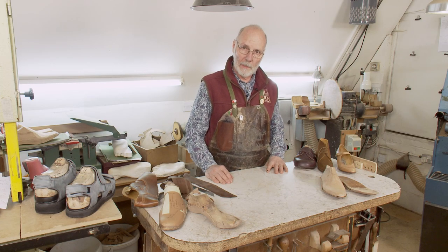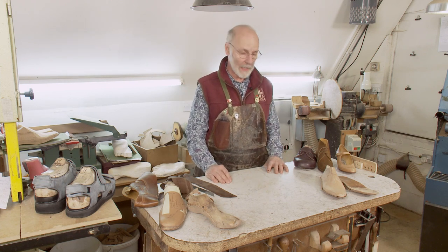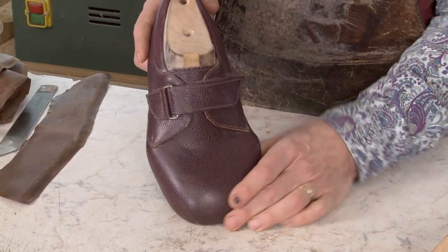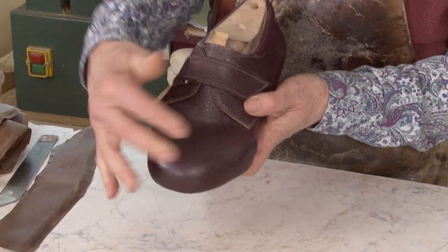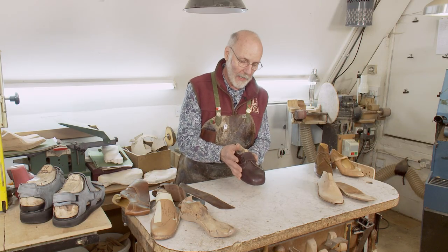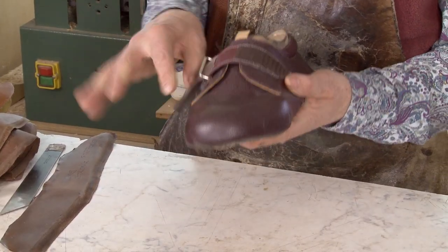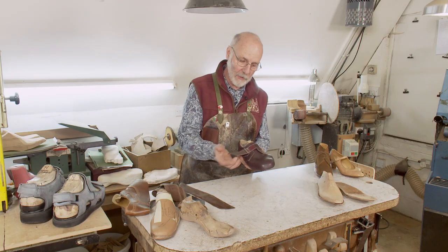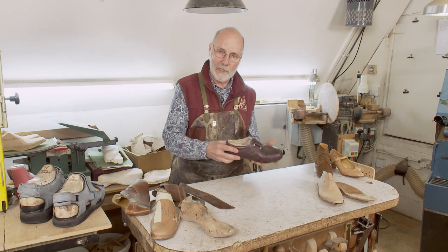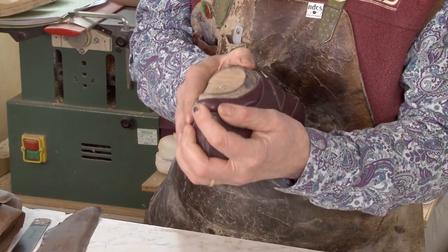A lot of what we do in bespoke orthopedic footwear can readily be seen from the outside. For instance, if you look at this shoe, you can see the shape — that it's hugely distorted, that there's this big bulbous toe there. That's all apparent from the outside. You can see we have a returning Velcro strap, because his hands are as arthritic as his feet are, and so he needs that assistance to do it up. You can see the cushion collar, which is supporting his ankles.